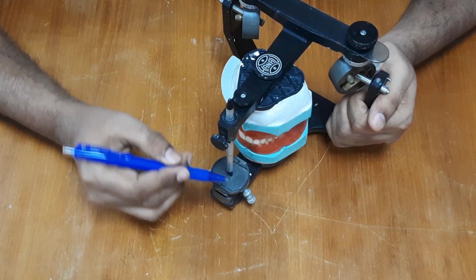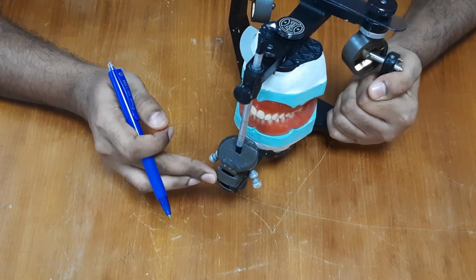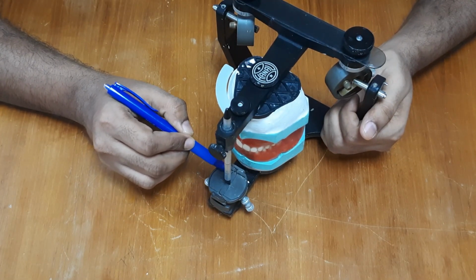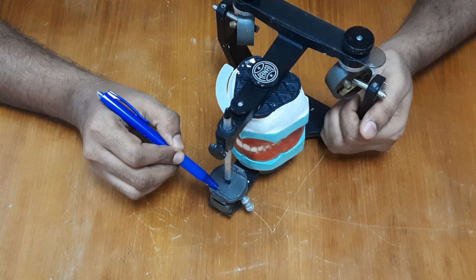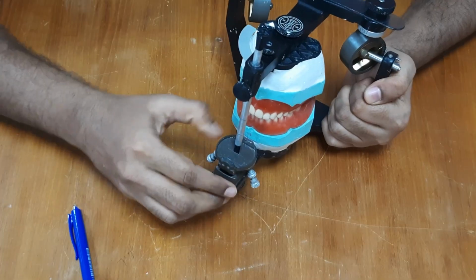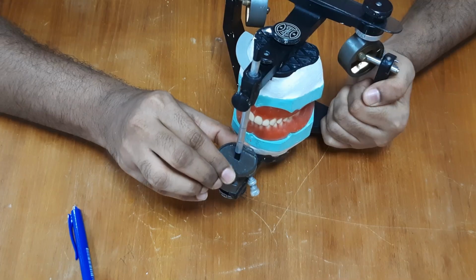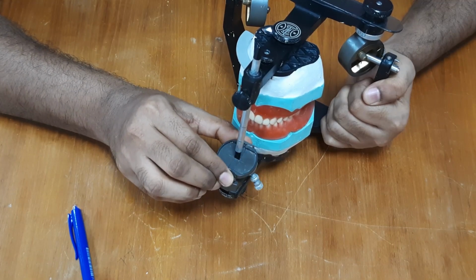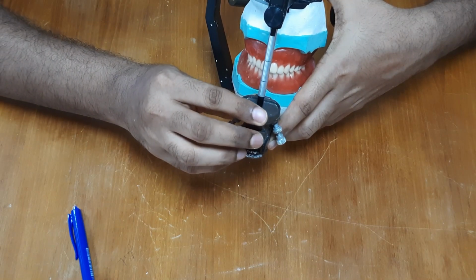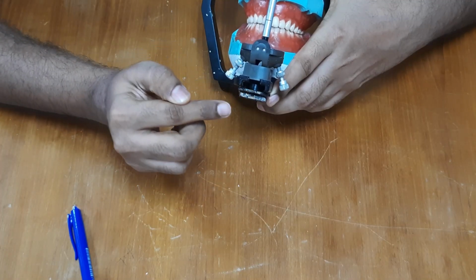Next, we have the incisal guidance. The incisal guidance rests on the platform of the lower member. There is a rectangular flat strip of metal in the center which generates incisal guidance. The incisal guidance can be adjusted anteroposteriorly. This is for a protrusive incisal guidance. It can be adjusted from 0 to 40 or 60 degrees, and then after it has been adjusted, it can be locked in place with a lock screw and a lock nut.